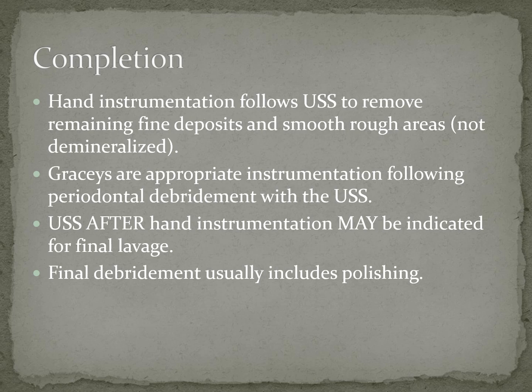And then if you've removed some more pieces and you want to go back in and lavage again with your USS, that is perfectly fine. And then we're going to usually end with our polishing, right? Because that's what our patients think makes everything clean, is the polishing.